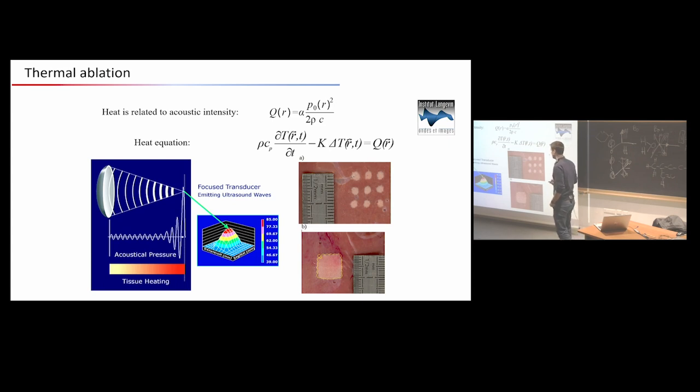So you see here a beam profile. This is the probe, we are emitting a wave at this focal spot, and this is a representation of the acoustic pressure. If you are, for example, here, in the first centimeter of the brain, nothing or almost nothing is transmitted, and all the pressure is transmitted at the focal spot. So the only biomechanical effect will be at the focal spot. Nothing will happen along the trajectory, in the beam pathway.